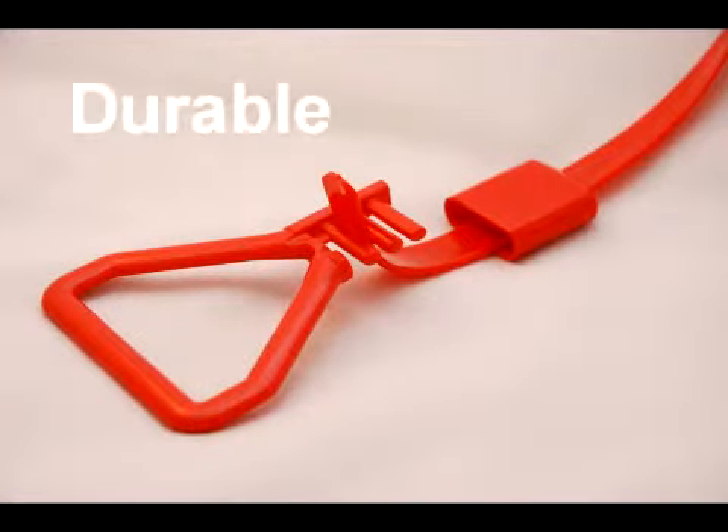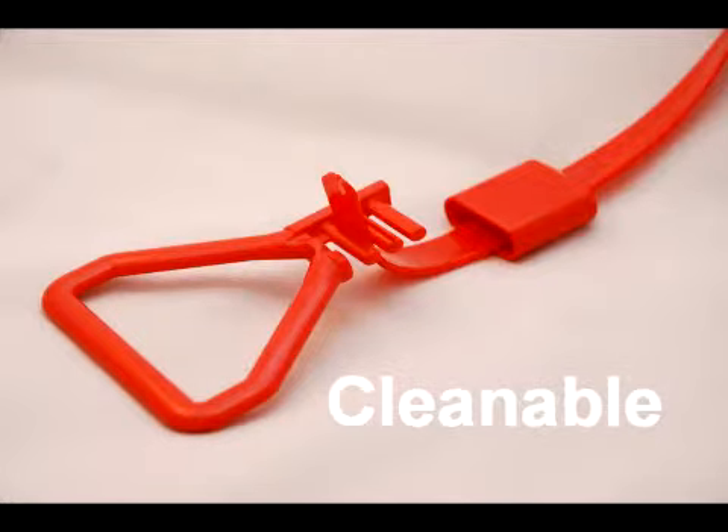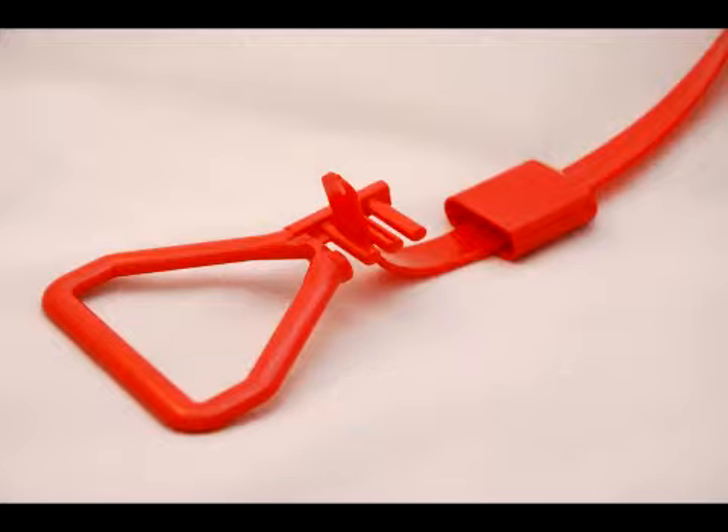SaniPull replacement cords are designed to be durable but have the added bonus of being cleanable. Manufactured from vinyl, there is no way for the bacteria to grow other than the surface, which is easily sanitised as part of the hospital cleaning programme.